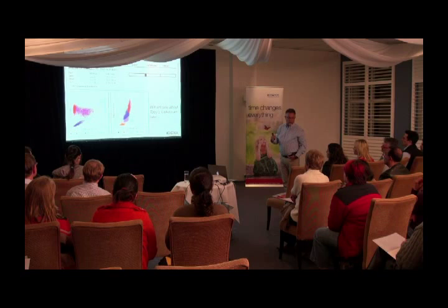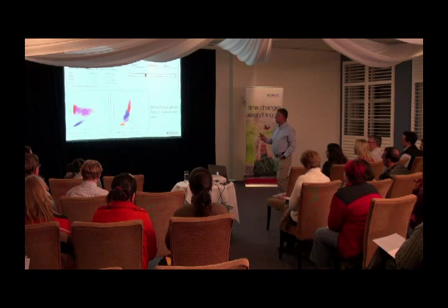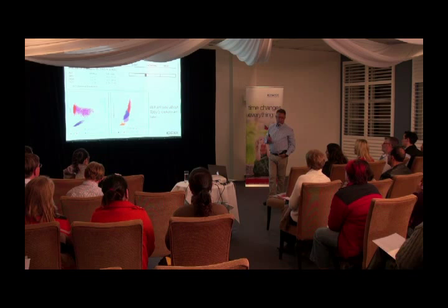We always have to negotiate how sensitive you want the instrument to be, because remember, if it's really sensitive, it's going to flag a lot of things. And for the bands, you can see a really nice inflammatory leukogram there with bands or toxic changes. It has an 85% sensitivity and a 95% specificity. So when you see it, it's the real deal. So it works very, very well.